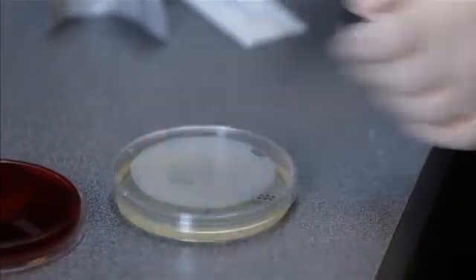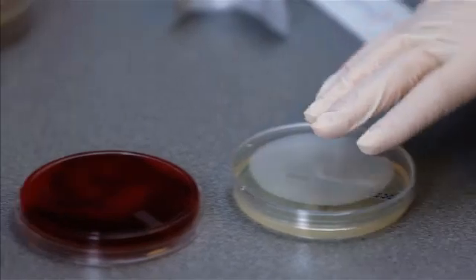Incubate plates in an inverted position to prevent the formation of condensation on the agar surface.